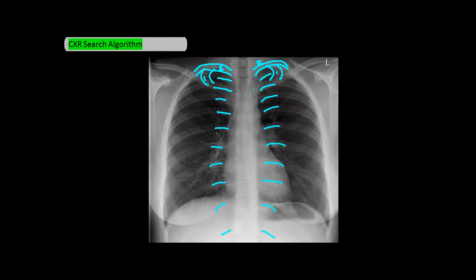What you're looking for by examining all these bones is any fractures, displacement, or abnormalities. You also want to take a look at the spine to see if anything appears abnormal. The spine should be relatively straight, you should be able to see the different discs, and the spinous process should be at the midline.